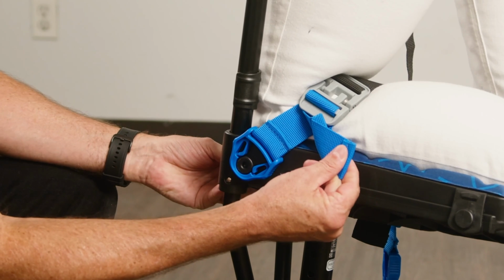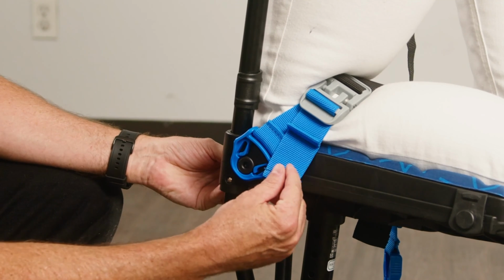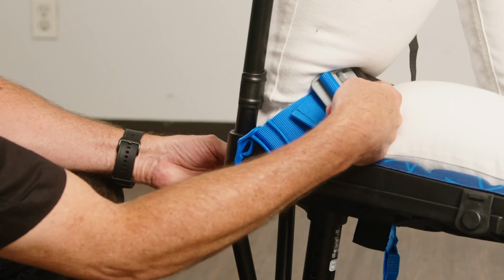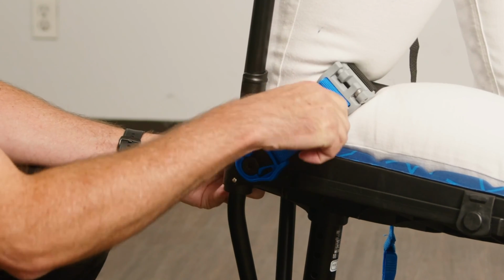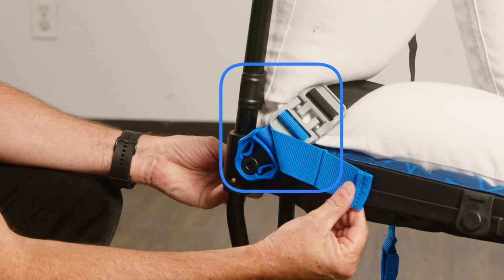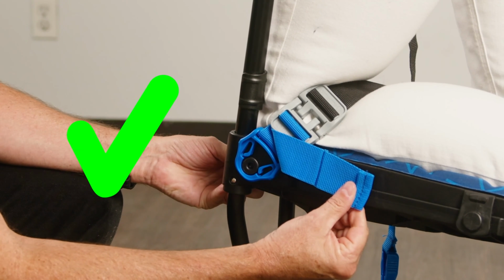If the buckles are too far apart, loosen the blue section. Then slightly lengthen the black section by lifting up on the gray buckle. Retighten the blue section and check your adjustment. Repeat the process until the strap length and tension are correct.